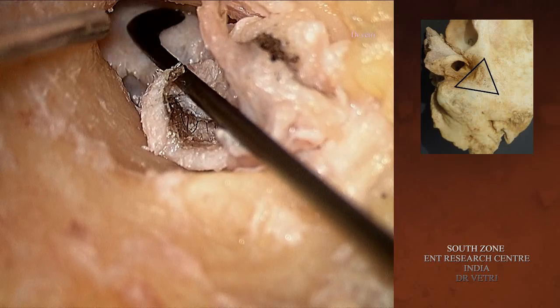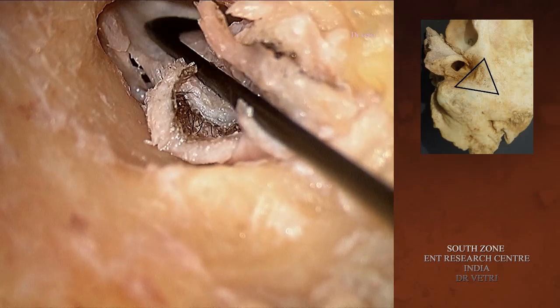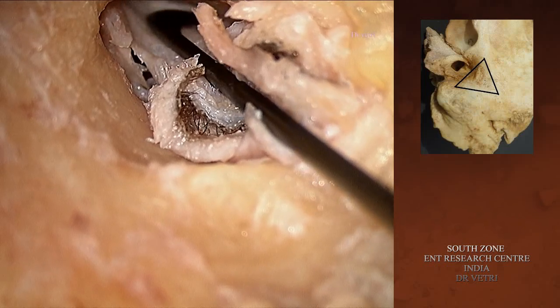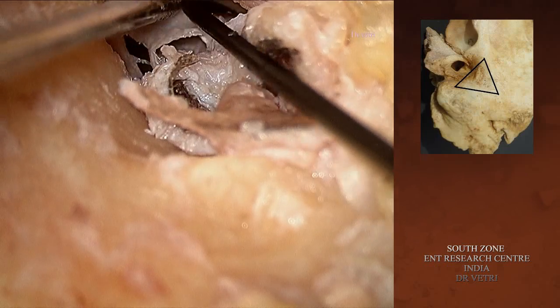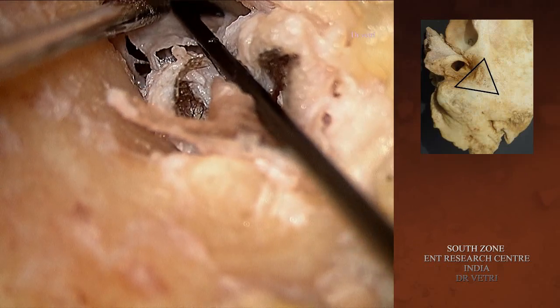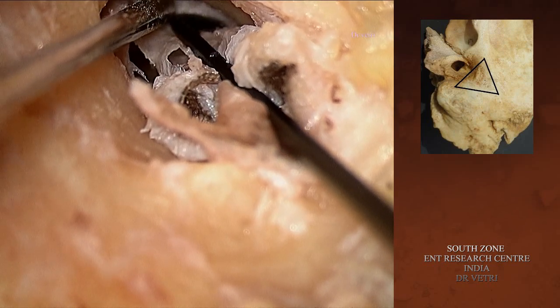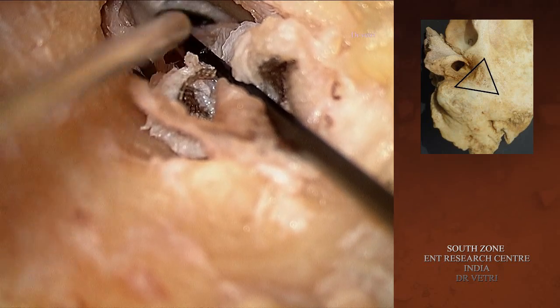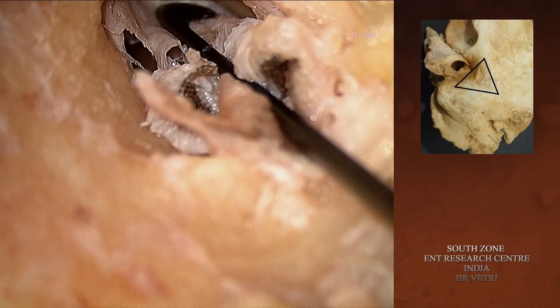Now the inferior wall and the anterior canal wall skin in the deeper part is elevated with a plaster knife. See how beautifully the tympanomeatal flap is elevated up to the annulus anteriorly.